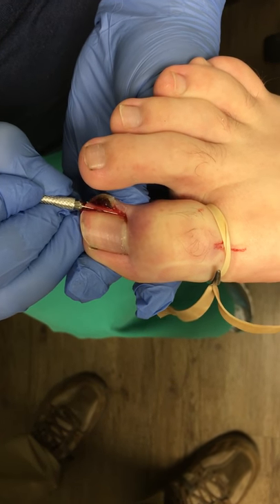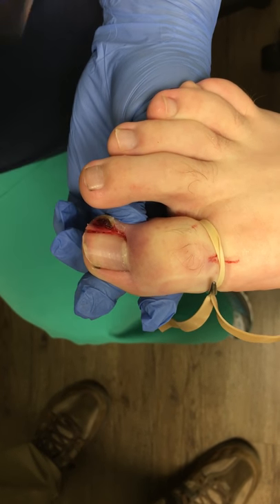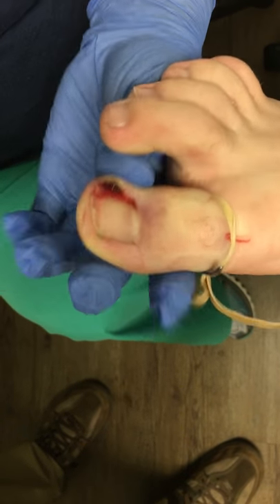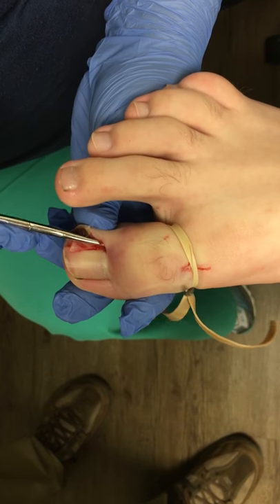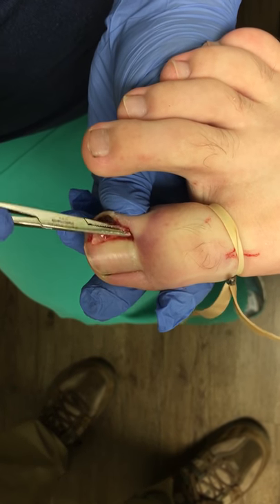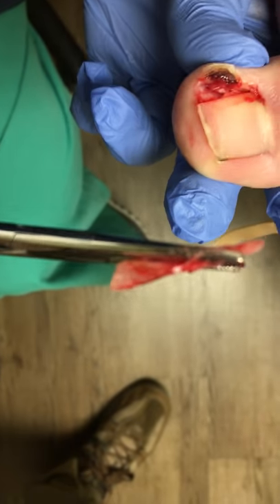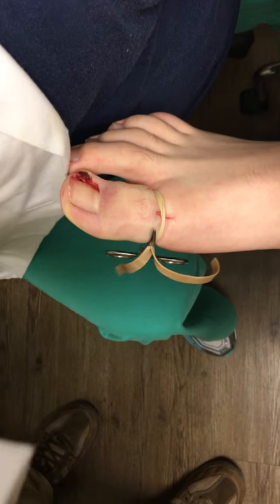Try not to, but it's not the end of the world if you do slip the nail, the skin right here. Then we use a straight hemostat to remove the nail. You want to go all the way down as far as you can to get that root. Clamp it off, and then you're going to twist and pull out. And that is your nail piece.